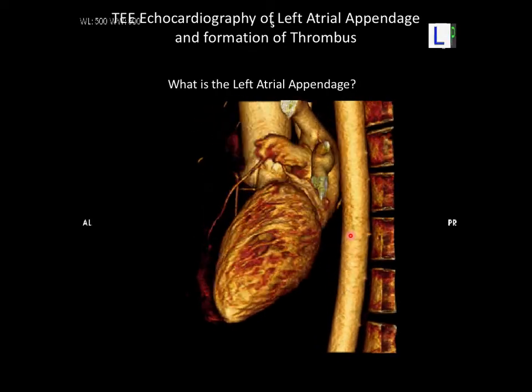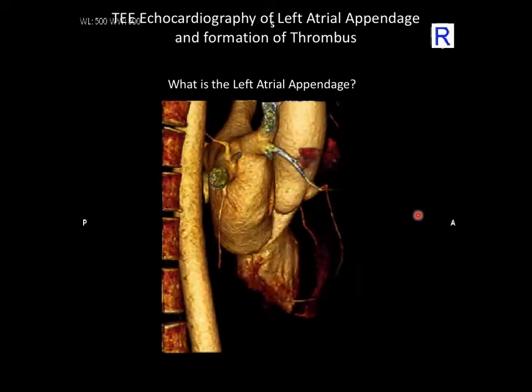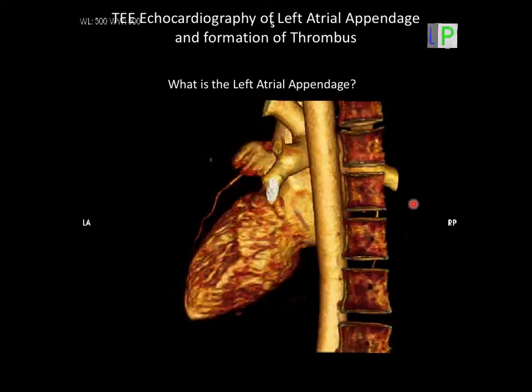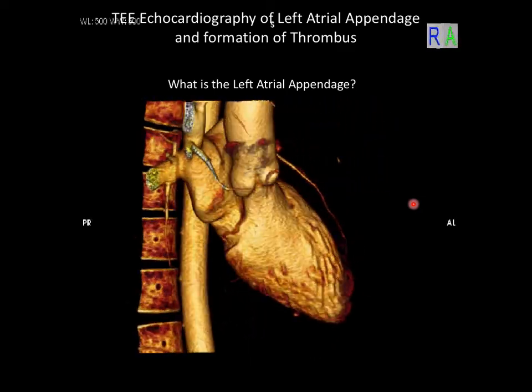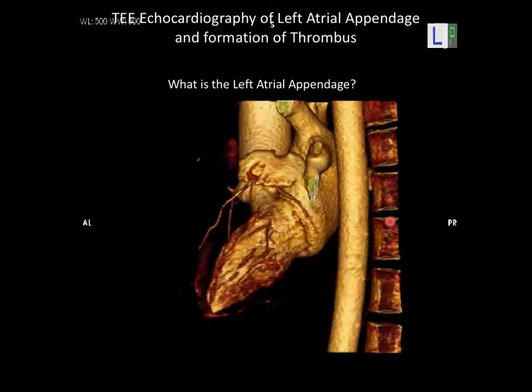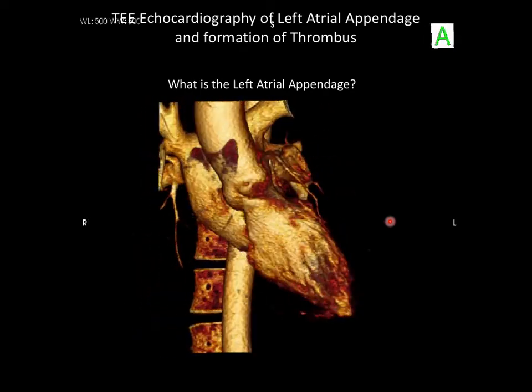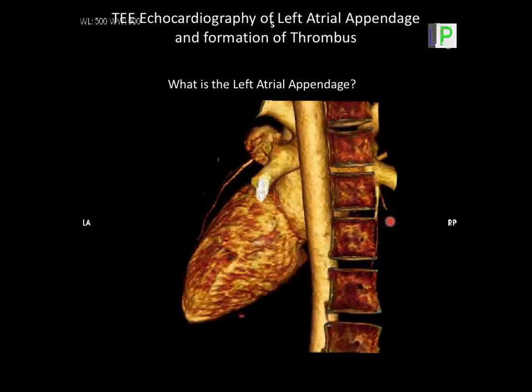So we've been looking at echo. This is not echo. This is CT. And this image was obtained probably from 2 heartbeats that were separated by 1 beat. Because the detector on this scanner actually is only 8 centimeters. It's not the big detector. It's like a half-size detector. And so you go boom, boom, and you get 2 volumes, but there was enough contrast in this case, and the heartbeats were identical. You can't even tell there's 2 volumes were taken here.